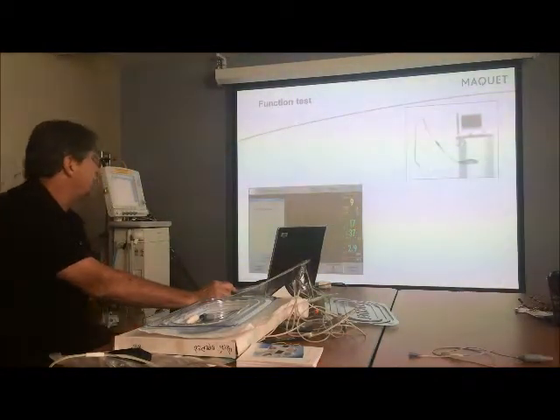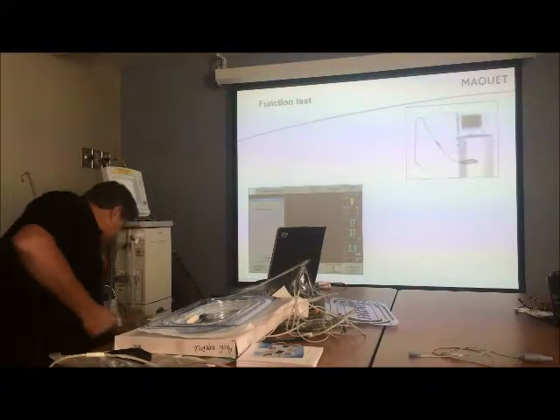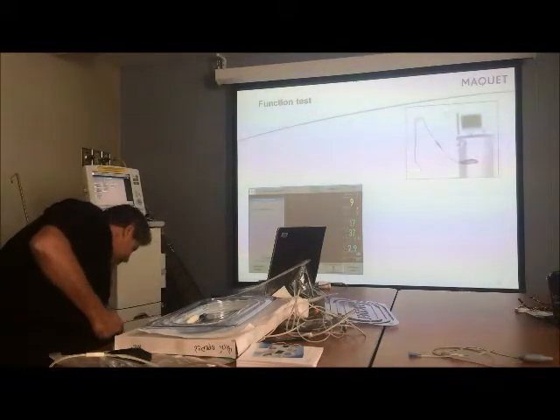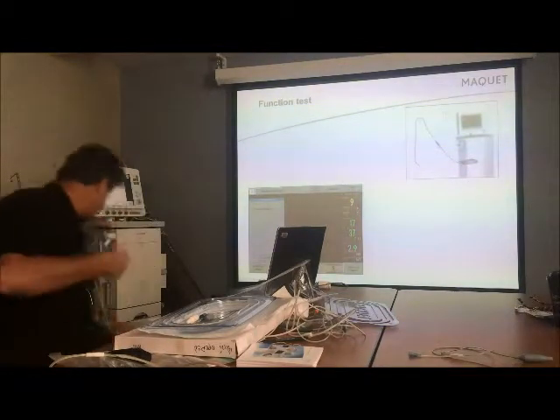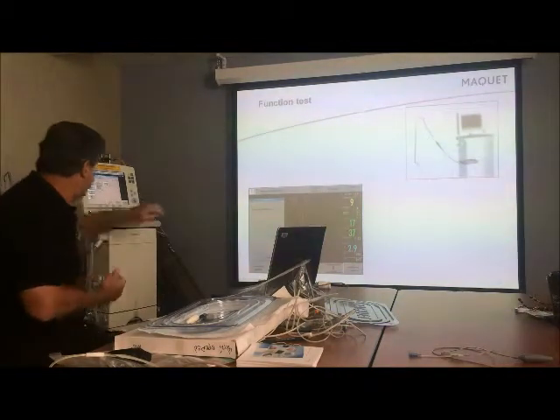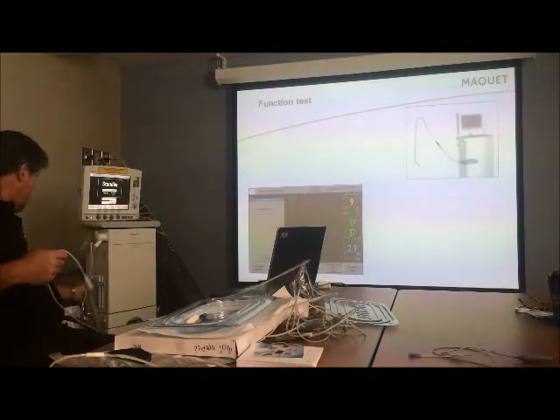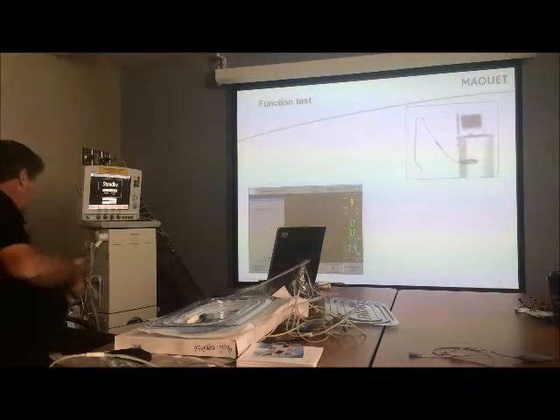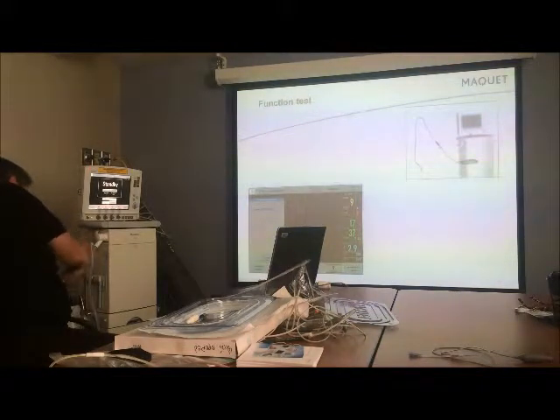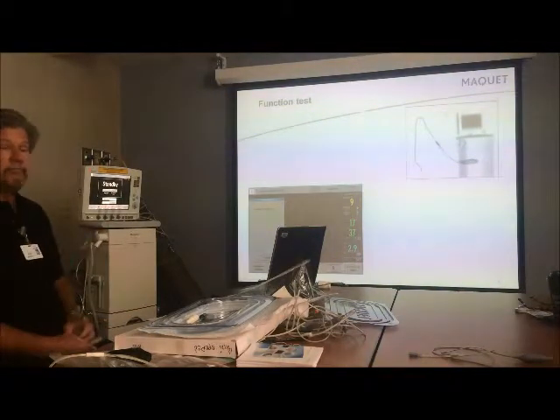And lastly, and then I'll switch to the ventilator and we'll take a little break, but one of the things that we'll want to do from just a technical standpoint is, so the ventilator's running on a patient.